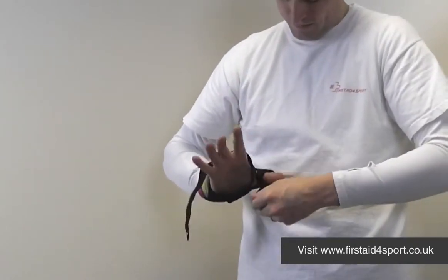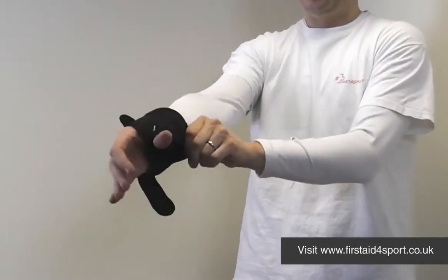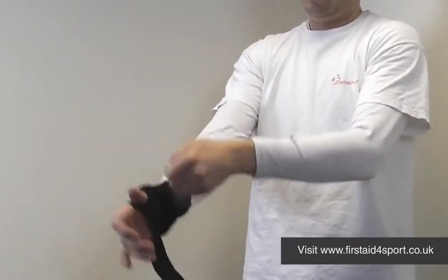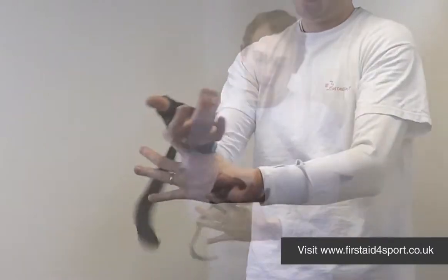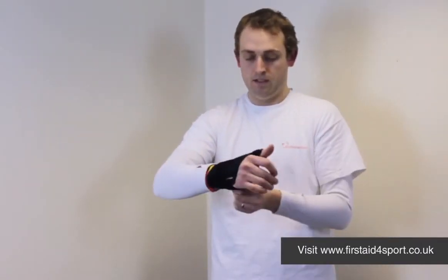On the thumb is a thumb strap, and then you simply tighten the Velcro at the top, and then wrap the Velcro around your wrist and back on itself — and it's a really comfortable brace.